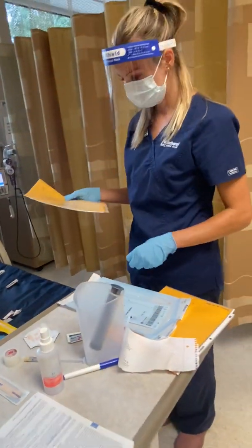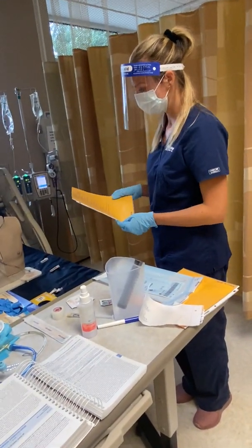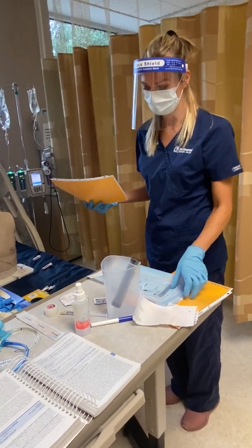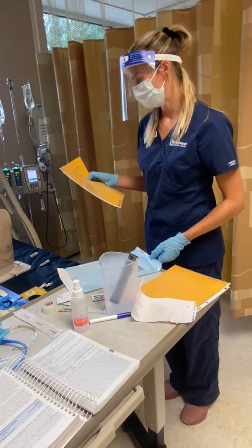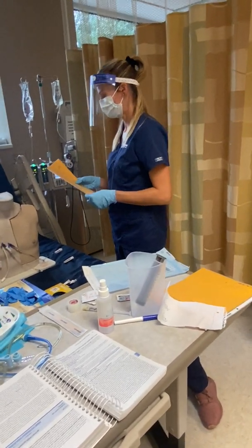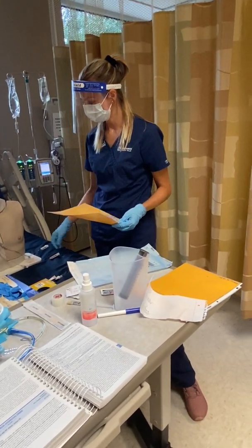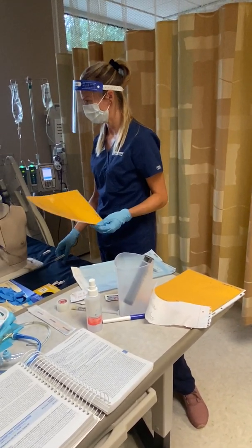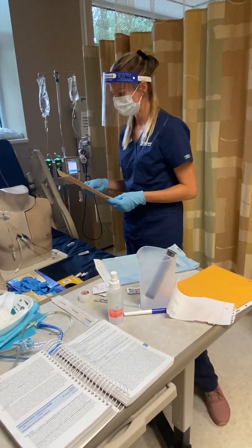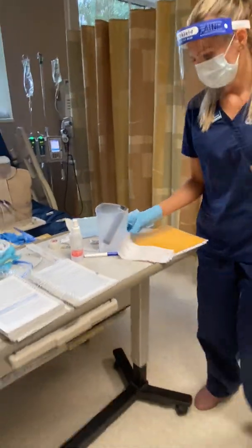Okay, all right, so the next thing that I'm gonna do, Jane, is I'm gonna get your medication running for your nausea. The doctor's prescribed Zofran for you, which is a nausea medication, and I'm gonna be giving that to you through your bolus line right here, so I don't have to poke you with a needle or anything like that. So just give me a second. I'm just gonna get this all set up for you.